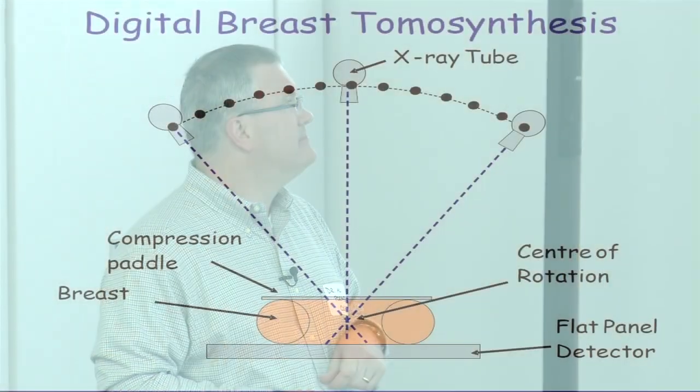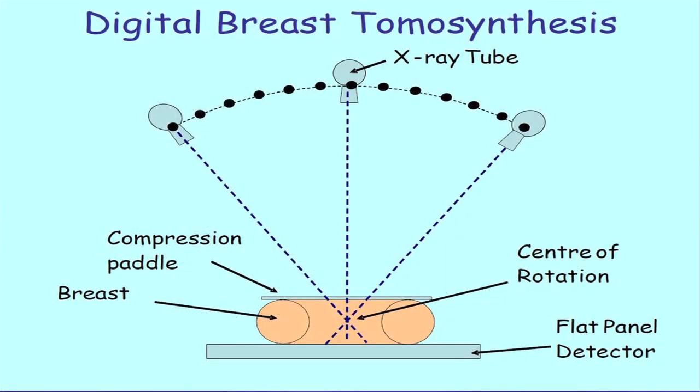Next, please. So we talked about tomosynthesis earlier. I mentioned it. Now, do you remember that fatty breast? How I said, boy, you could put something 5 millimeters, a centimeter behind one of those big, dense lobules, and I really would have a very slim chance of seeing it. Tomosynthesis gets us around that a little bit. Tomosynthesis is to mammography what CT is to x-rays.